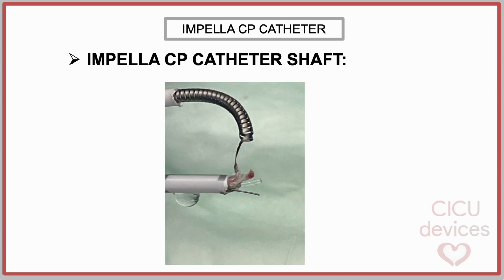We can observe these elements when cutting the catheter shaft, as seen in the photograph. The polyurethane cover, the nitinol coil wire reinforcement, the fiber-optic cable, the purge lumen, and the power supply line. Continues on Part 4.